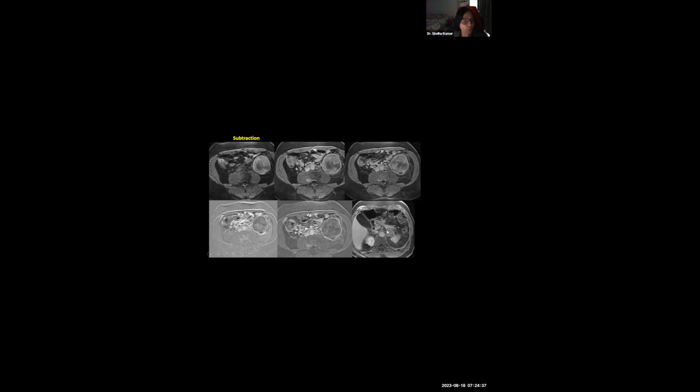This patient also had a left renal lesion, which looked very similar to this. There is an adrenal lesion, a nodular metastasis in the adrenal gland, which also had similar characteristics as the left papillary RCC, and it was also metastatic and was removed. So, papillary RCC, biopsy proven.